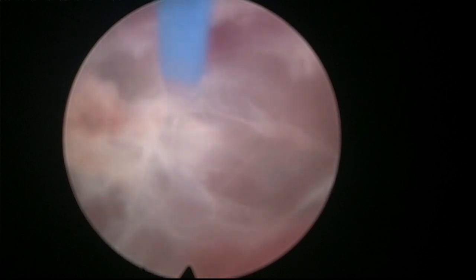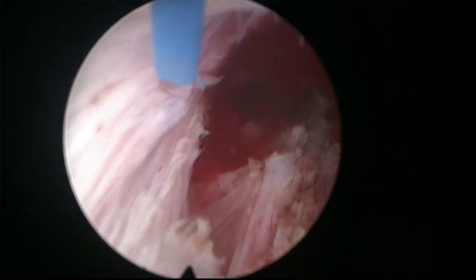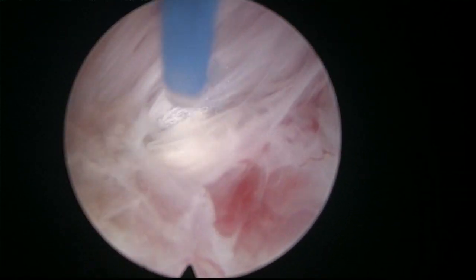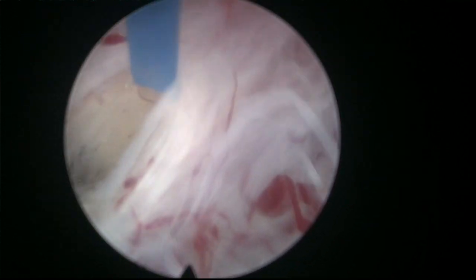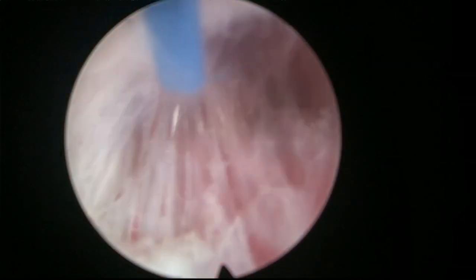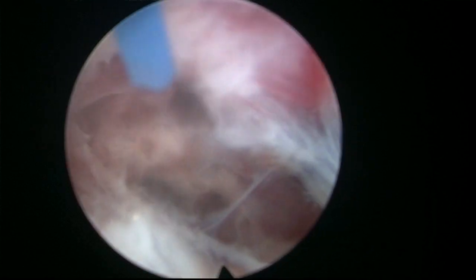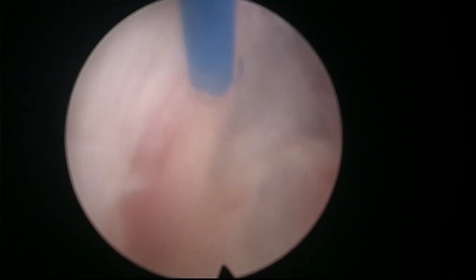So it doesn't mean that the patient is bleeding too much or anything. Sometimes if you get some distance you can see where the bleeding is coming from and control it a little bit better. But let's open the bladder neck a little bit more. We don't want a lot of vessels bleeding at the same time, but I think if we open the bladder neck, we will be able to see where these vessels are. And this is all bladder mucosa, you see? Bladder mucosa.